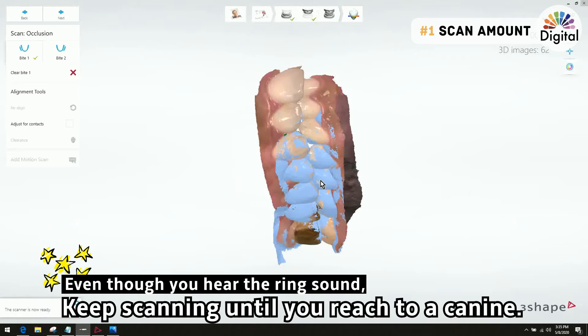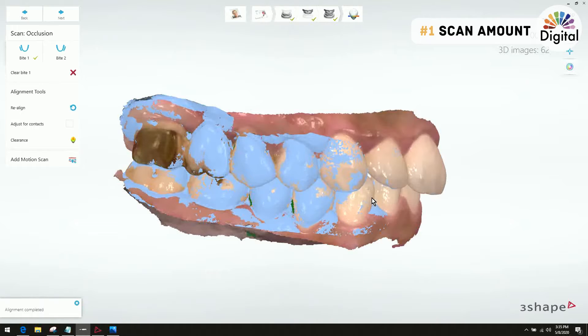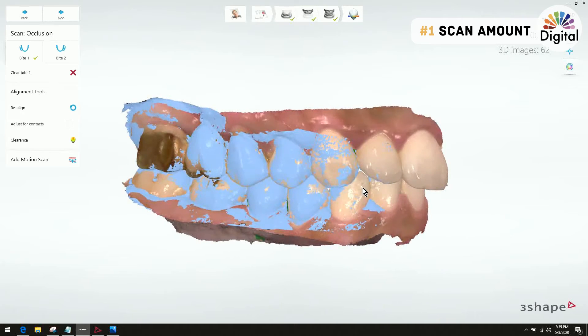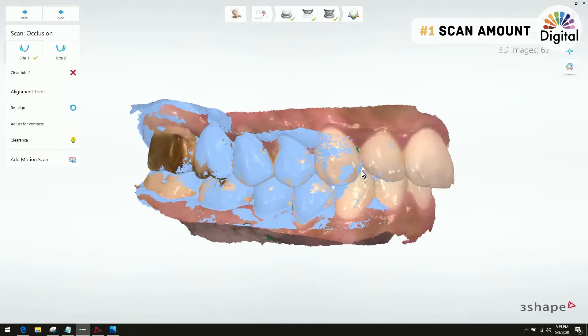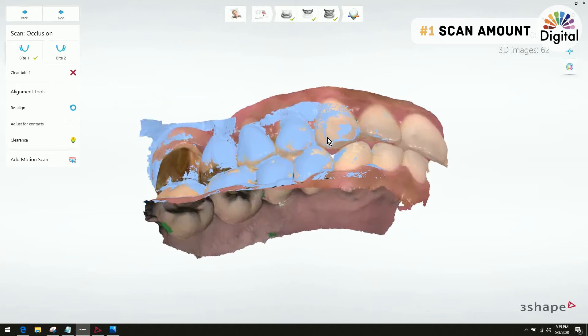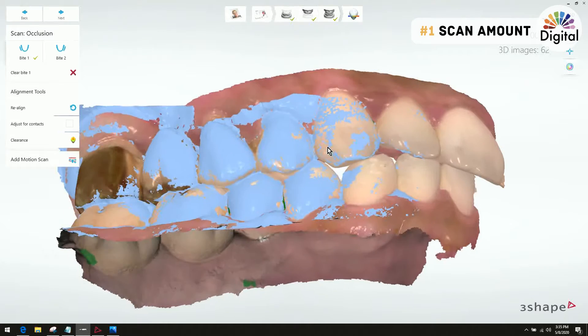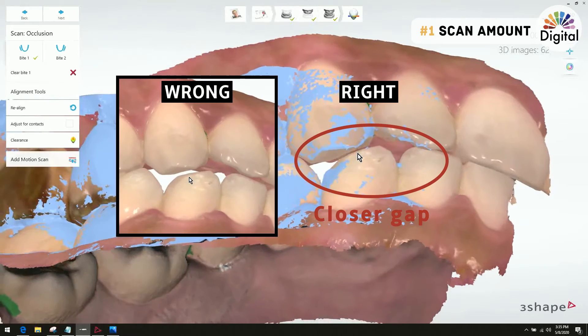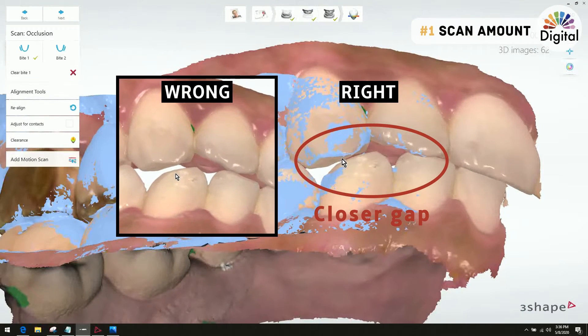Even when the system gives us sounds for automatic alignment, I keep going until the canine. Whenever we scan half or quarter arch, please make sure to do a full arch scan — it might be better because we'll have two different scan positions, right and left. Especially when you scan a quadrant or half arch, please make sure to do a little longer bite scan. We can see there is a lot less gap between the upper and lower canine.